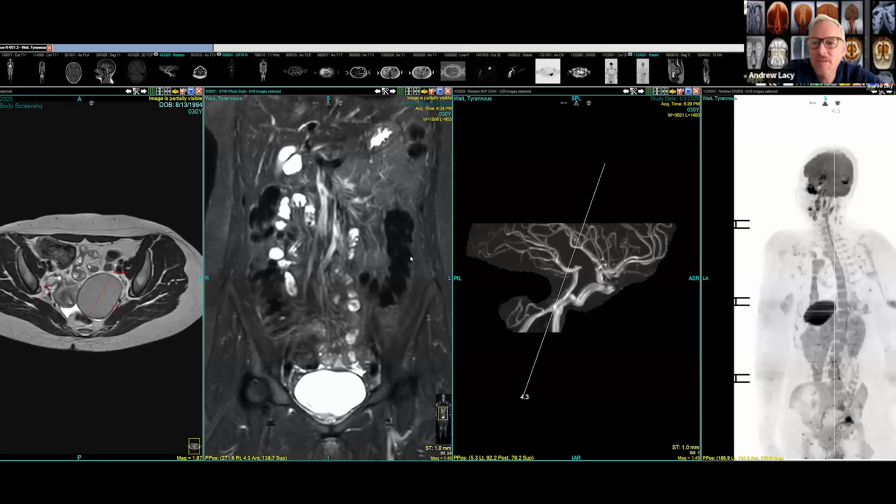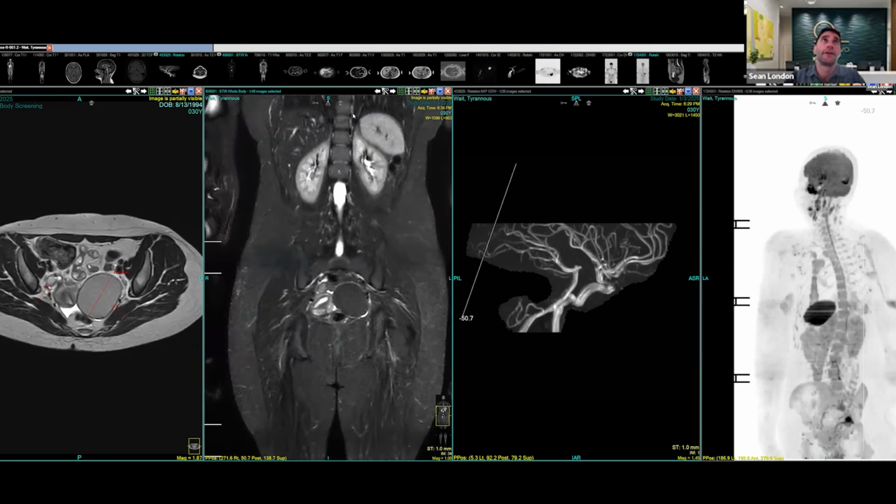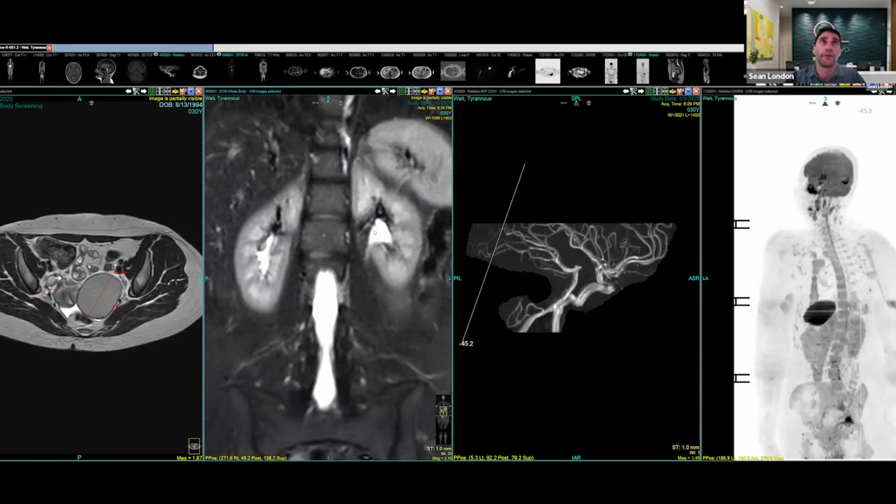Talk about kidney stones. There was a question that came in on one of the other channels. Thank you. I meant to talk about that when I was looking at the kidneys. Kidney stones don't show up well on MRI. I've seen even sizable kidney stones where I've had two different modalities next to each other, meaning CT and MRI, and it just lights up like a light bulb on the CT, but you cannot see it on the MRI. But what we can see, even if there are stones, are any signs of obstruction.